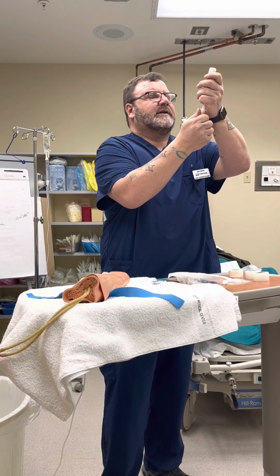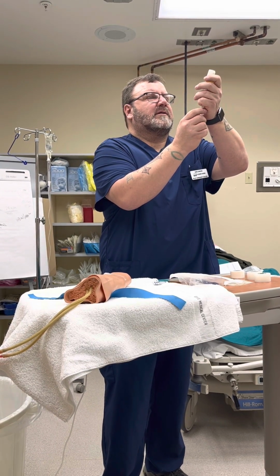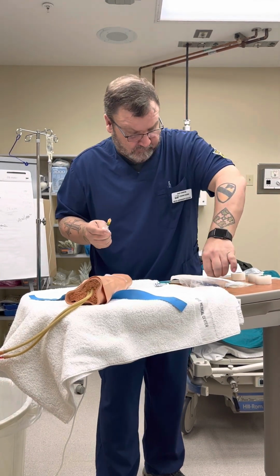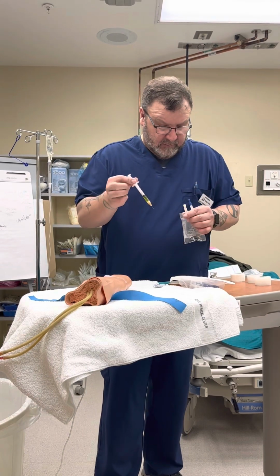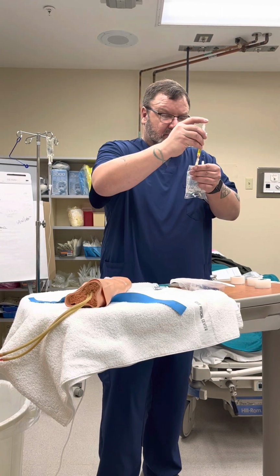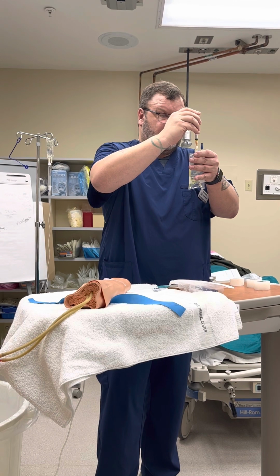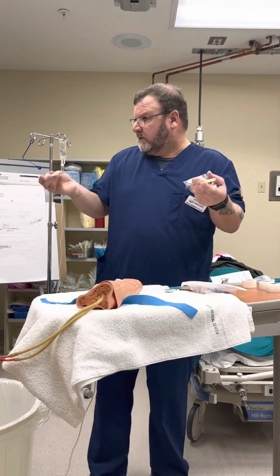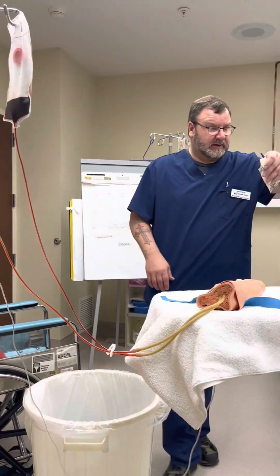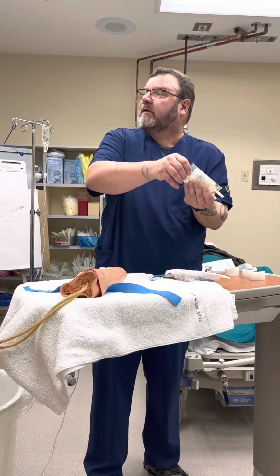So I have a 3 ml syringe here. 1.2 milliliters. Great. I am now going to go in the cleaned portion. So I will move this back and forth, dispose of this in a sharps, gently rock that back and forth.